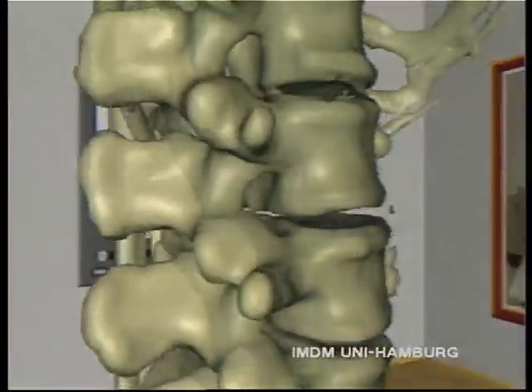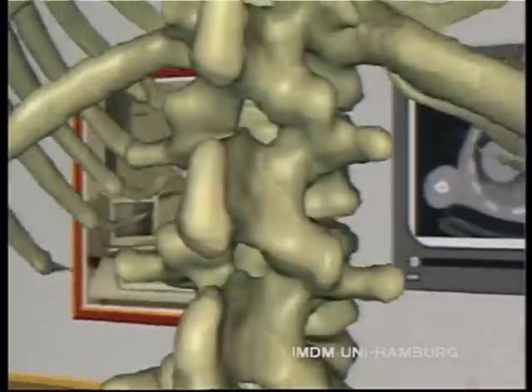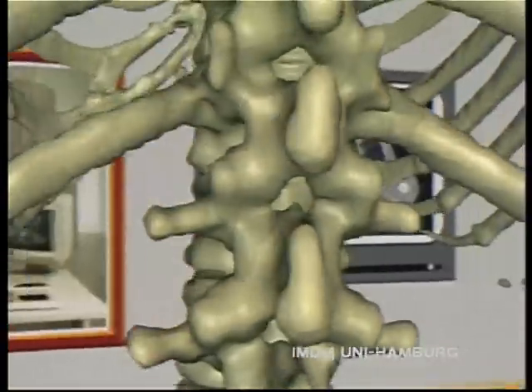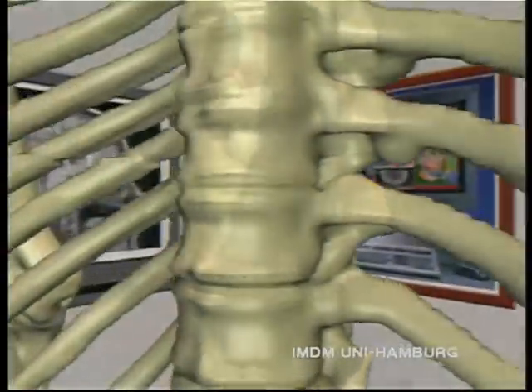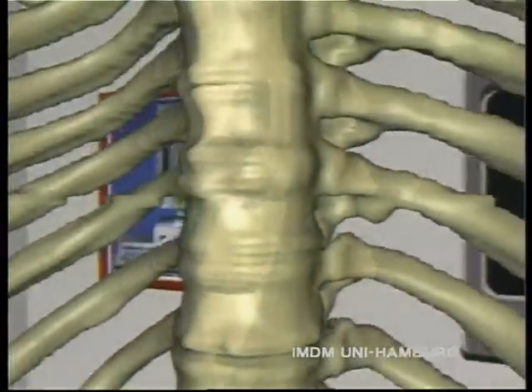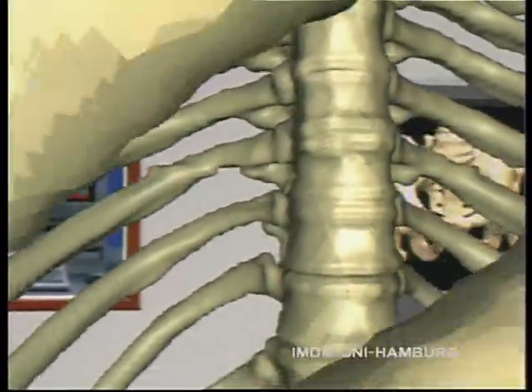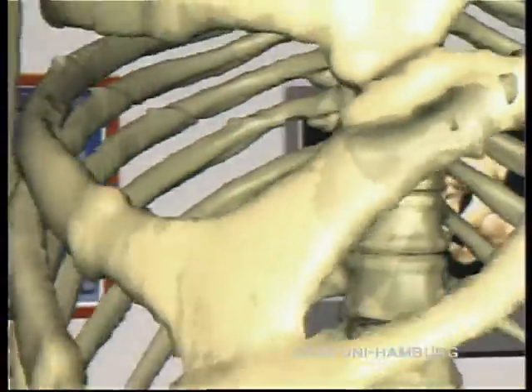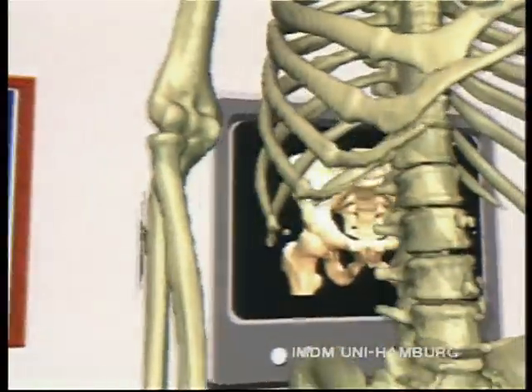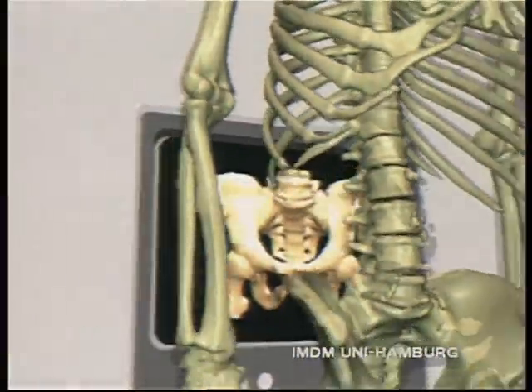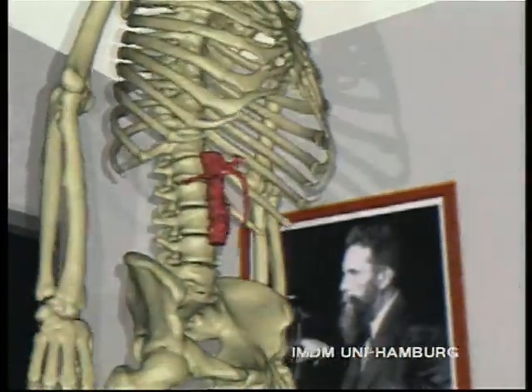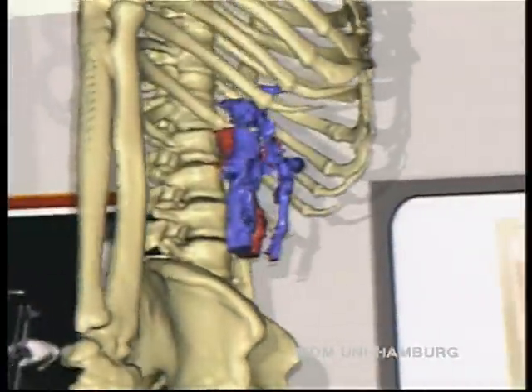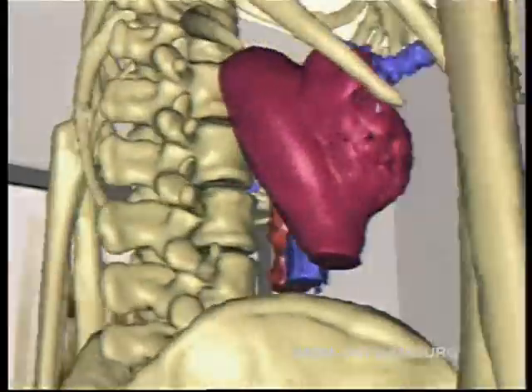Now we spiral upwards around the vertebral column into the thoracic cavity, and take a look from outside. Beyond mere bone imaging, the new technique of spiral CT delivers high-quality soft tissue data.